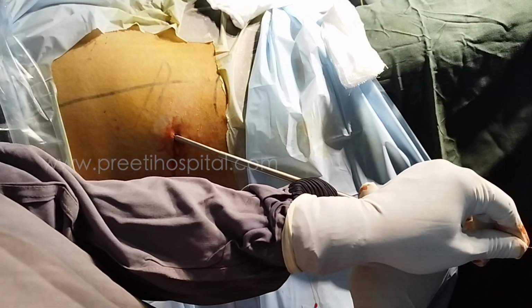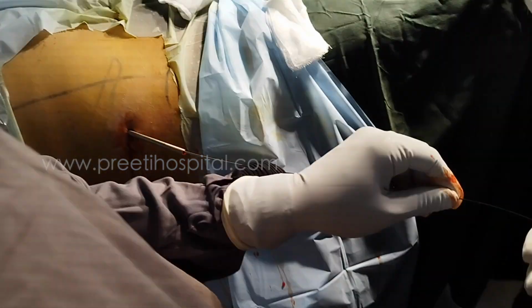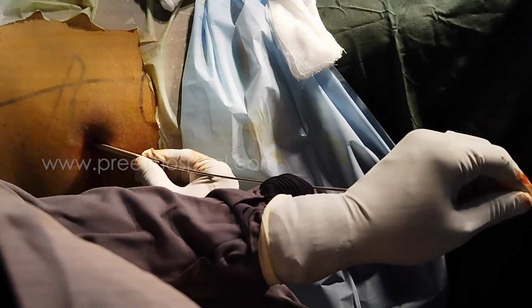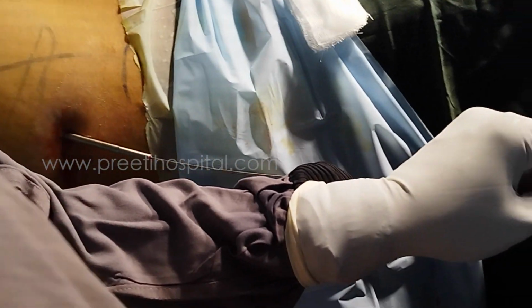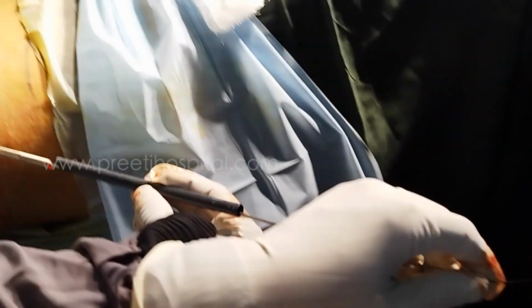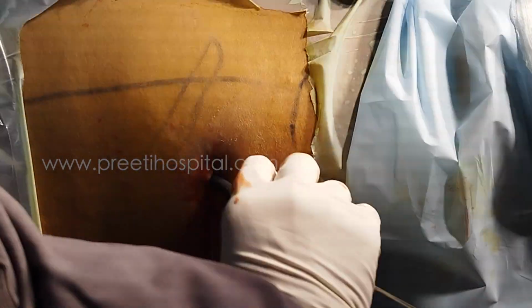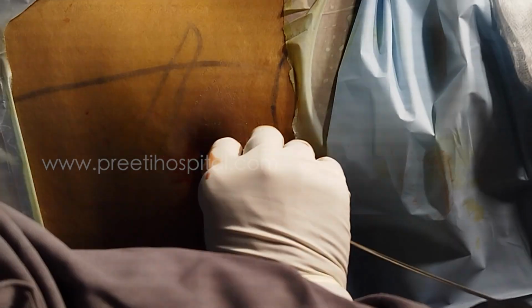Is it okay? Now one dilator I am keeping more. Why? Rectus sheath perforation. I have perforated now one step more, so that the next Amplatz sheath will go easily. Then bleeding will not happen. Amplatz is a big nuisance in supine PCNL. So now see how it goes. It will rotate 1, 2, because you already dilated.